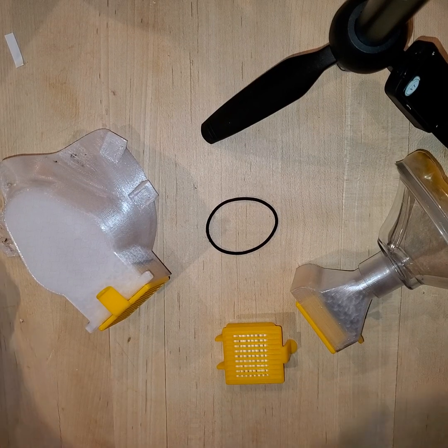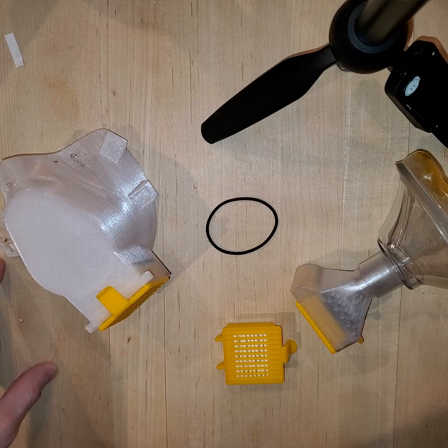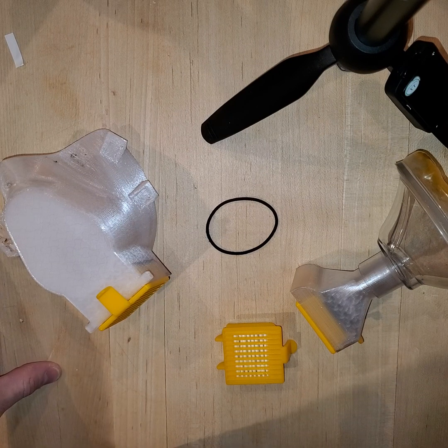Okay, so I'm making this very quick video. I've got longer videos on YouTube to cover this in a little more detail, but I wanted to just get this out there so I can put this away for a little while and stop working on it. So these are two different designs that I've put together, incorporating some other ideas I've seen out there.